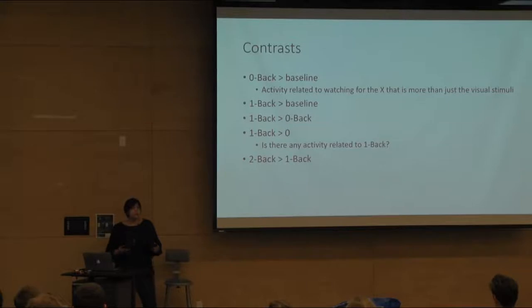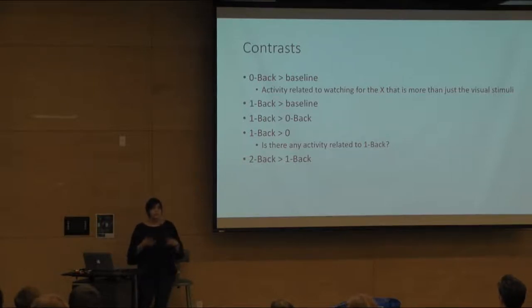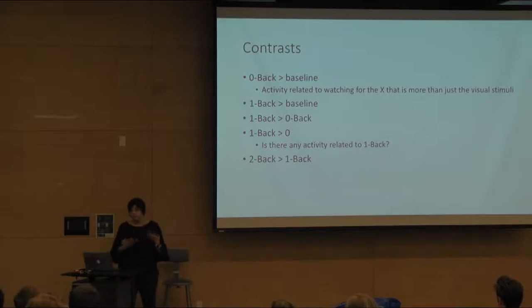Okay, and we can extend this idea. We have a one-back condition where we're looking to attend to whether the letter we see is the same as the one that preceded it. And we can compare that to baseline, and we can then look at what's related to this memory-related activity now, right? So it's not just response, it's memory. And we can do more than that. We can do a one-back versus a zero-back and isolate it to just the difference between seeing a letter that you're trying to remember versus not.